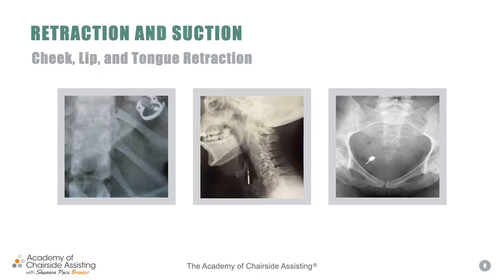So one of the things that we know now in dentistry is we are taking more precautions. But the great thing about being in dentistry this day and age too is there's so many new products coming out, and we are constantly seeing new items coming from manufacturers to help our lives and make it easier when we think about any patient ingesting any piece of equipment or aspirating any dental instruments. The last thing we want is for a patient to swallow a clamp, a file, any type of equipment that we're utilizing for placing implants.